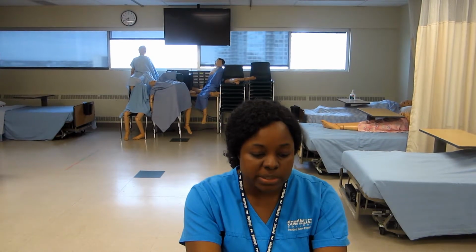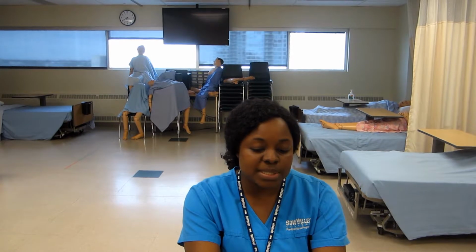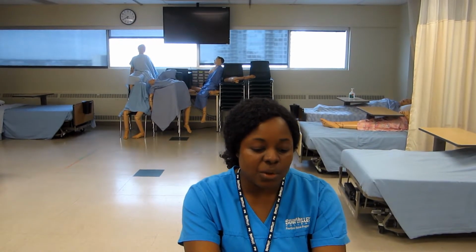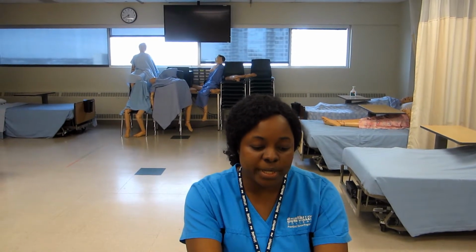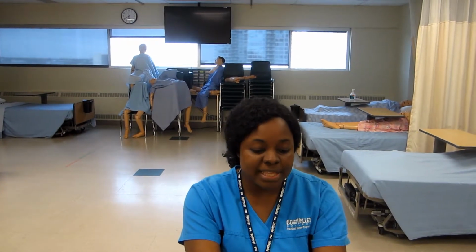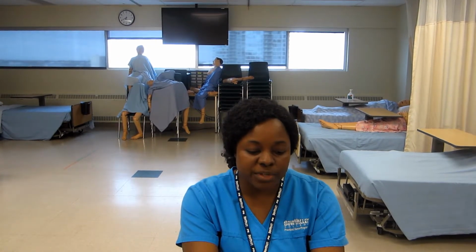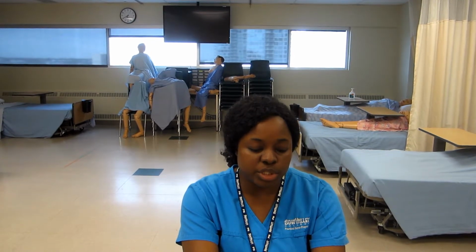Attach hooks on strap to holes in sling. The short straps hook to the top holes of the sling, and the longer straps hook to bottom of sling and are crossed over one another. Elevate the head of the bed and get patient to fold arms over chest. This positions the patient in sitting position.